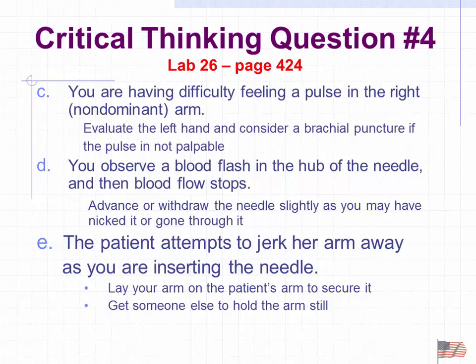You observe a blood flash in the hub of the needle and the blood flow stops. Again, if you can't get it by advancing or withdrawing, then you probably have, like I said, a tissue flash.